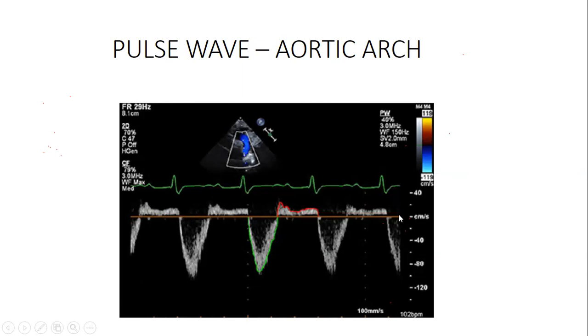Mr. Moab, I think we talked about aliasing. Okay, so aliasing, when you look at this, this is about 80 centimeters per second. This is the velocity. So when the speed of blood is somewhere down here, it means the flow is so much. But remember, pulsed wave cannot pick high velocities. So it will have a wrap up on top there. That is called aliasing. There will be another image that will come like a line. It's an artifact. So to accommodate the high velocities, you adjust this up.